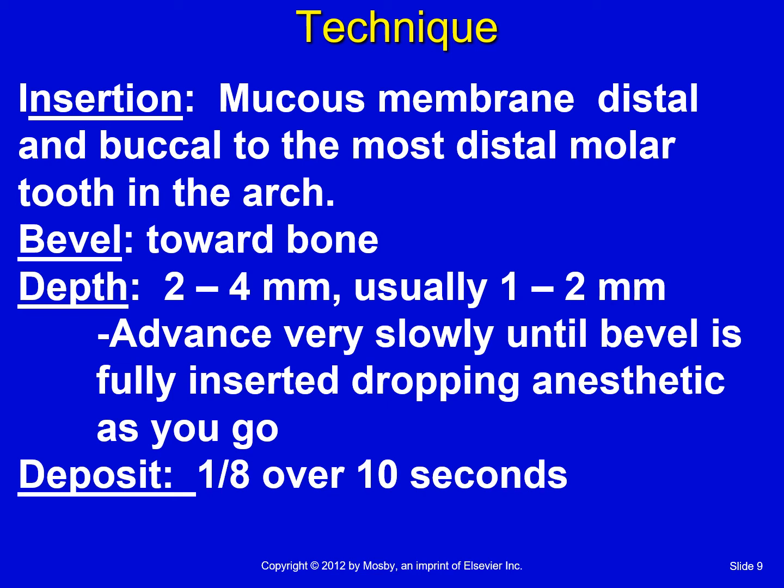So you need to advance very slowly, and it says to drop anesthetic as you go. Just want you to know that that is possible, but in reality, if you're only in 1 or 2 millimeters and you are depositing a drop of anesthetic, usually the bevel is not even fully in the tissue yet, and it will be leaking out into the mouth. So I don't usually do that. I just go in and contact the bone.